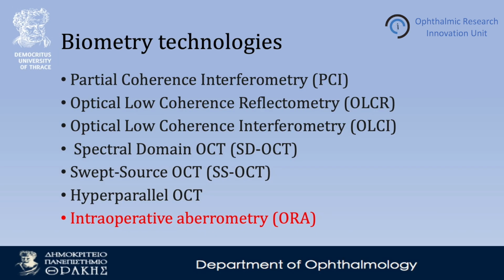Modern biometry technologies are used in pseudophakic presbyopic correction. Among them are partial coherence interferometry, optical low coherence reflectometry, optical low coherence interferometry, spectral domain OCT, swept source OCT, and hyperparallel OCT. All the aforementioned biometry technologies are included in the preoperative procedures of presbyopic corrections. However, there is a new biometry technology called intraoperative aberrometry, which performs intraoperative biometry, enabling the surgeon to intraoperatively assess ocular biometric data.